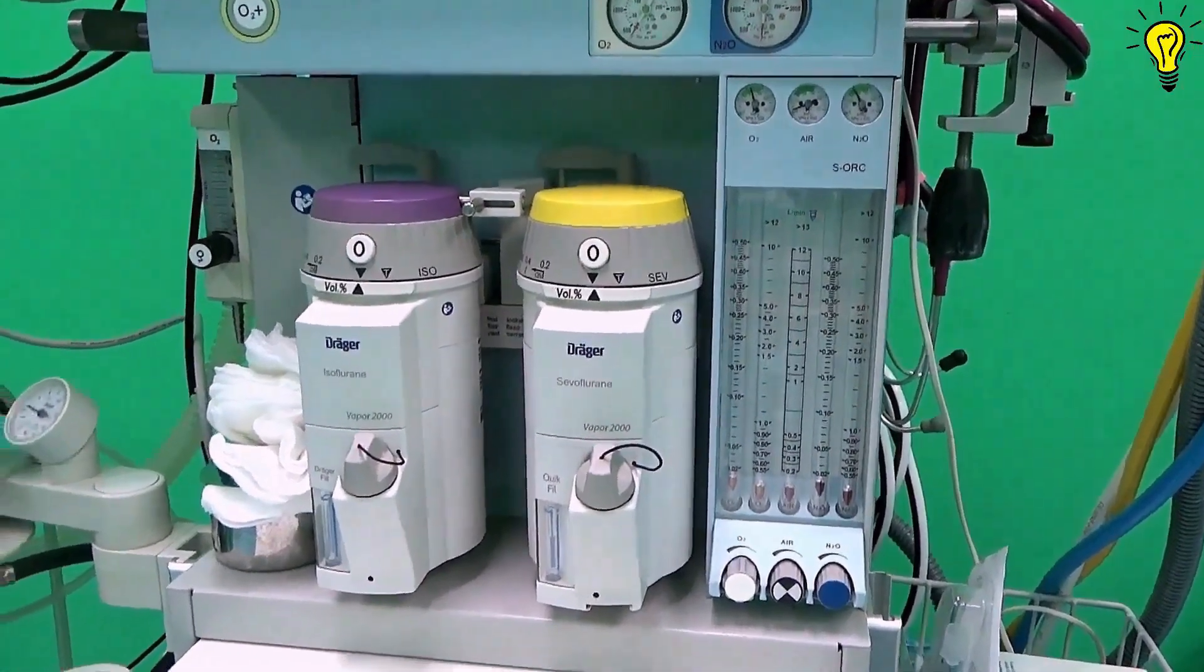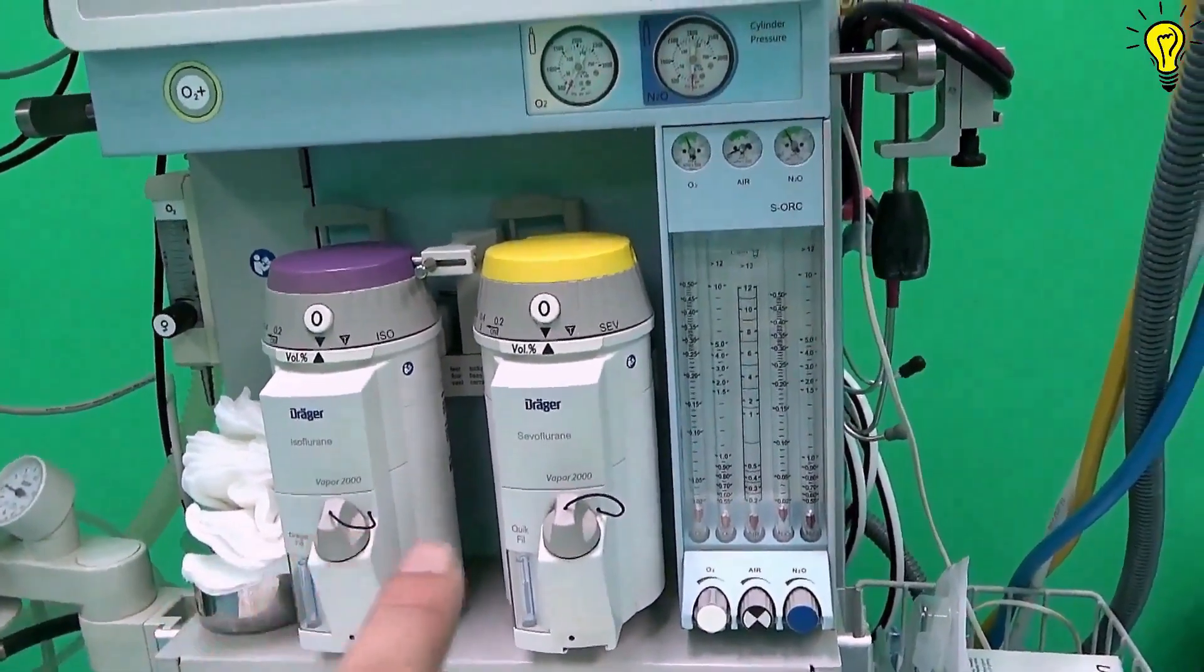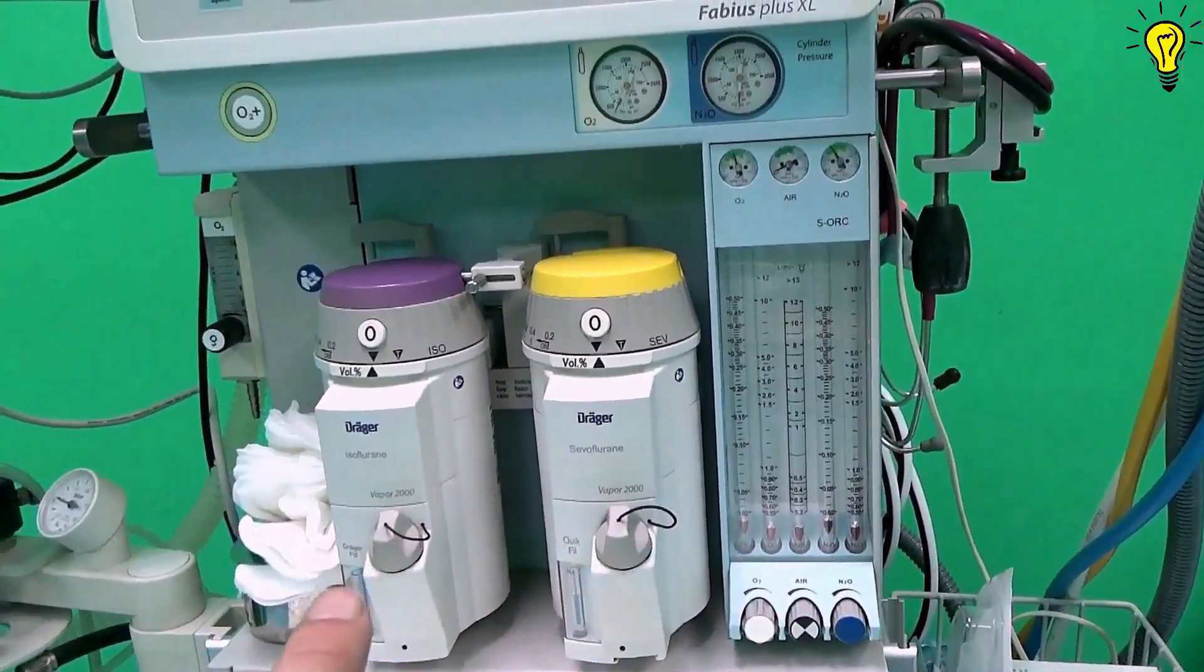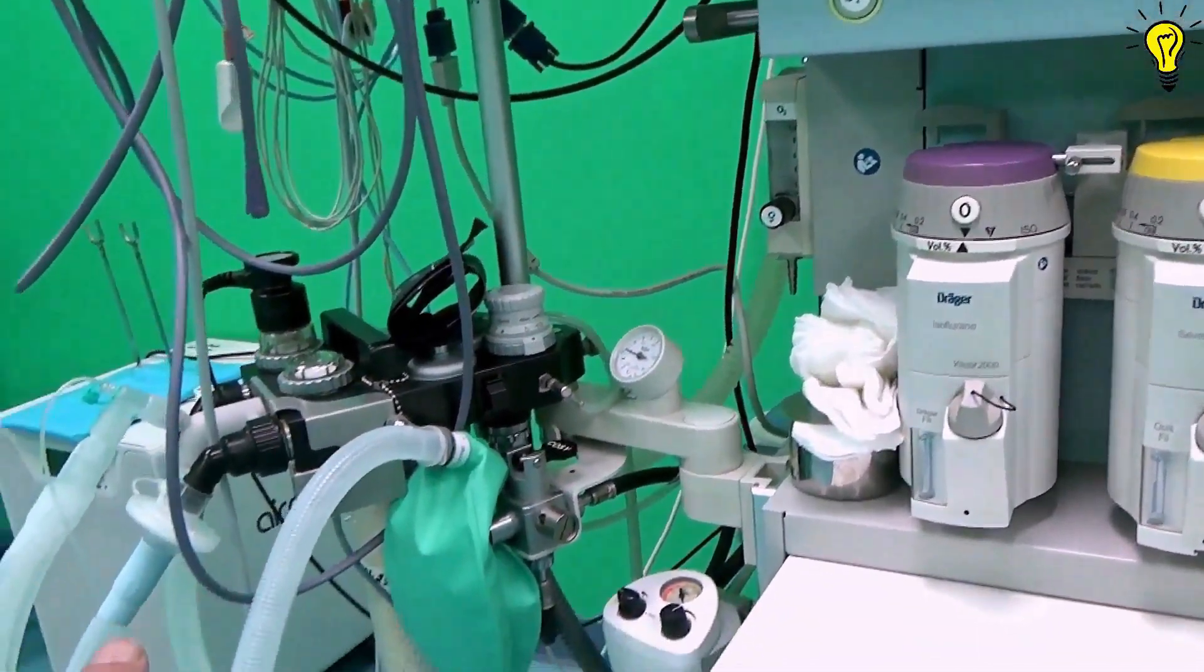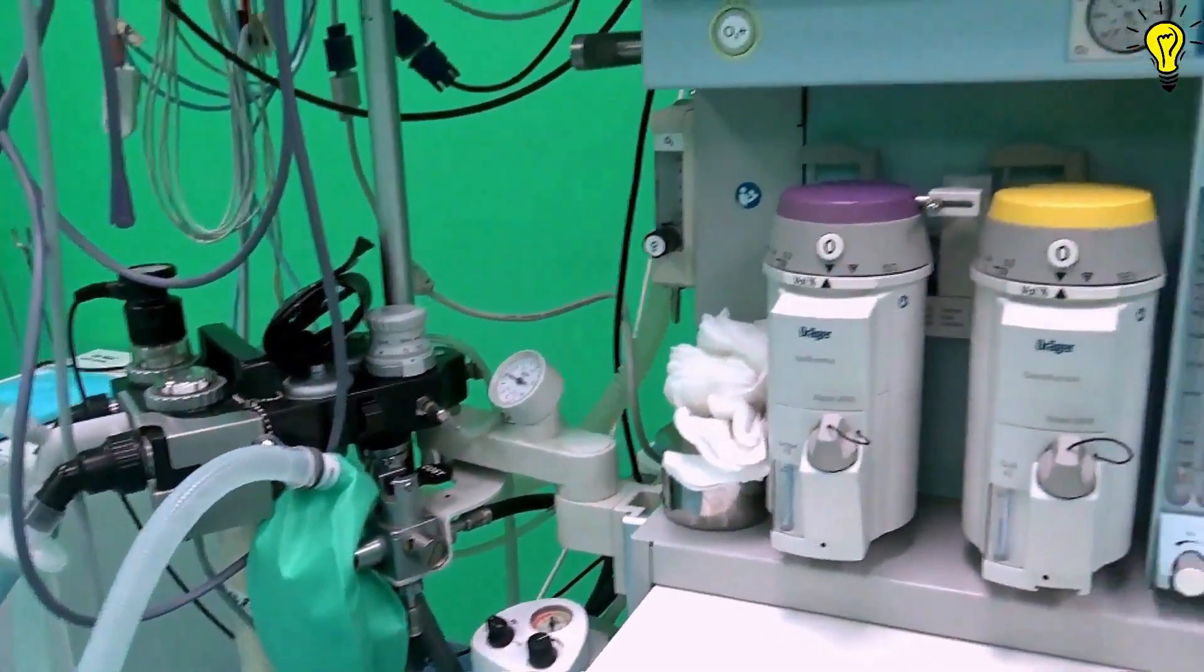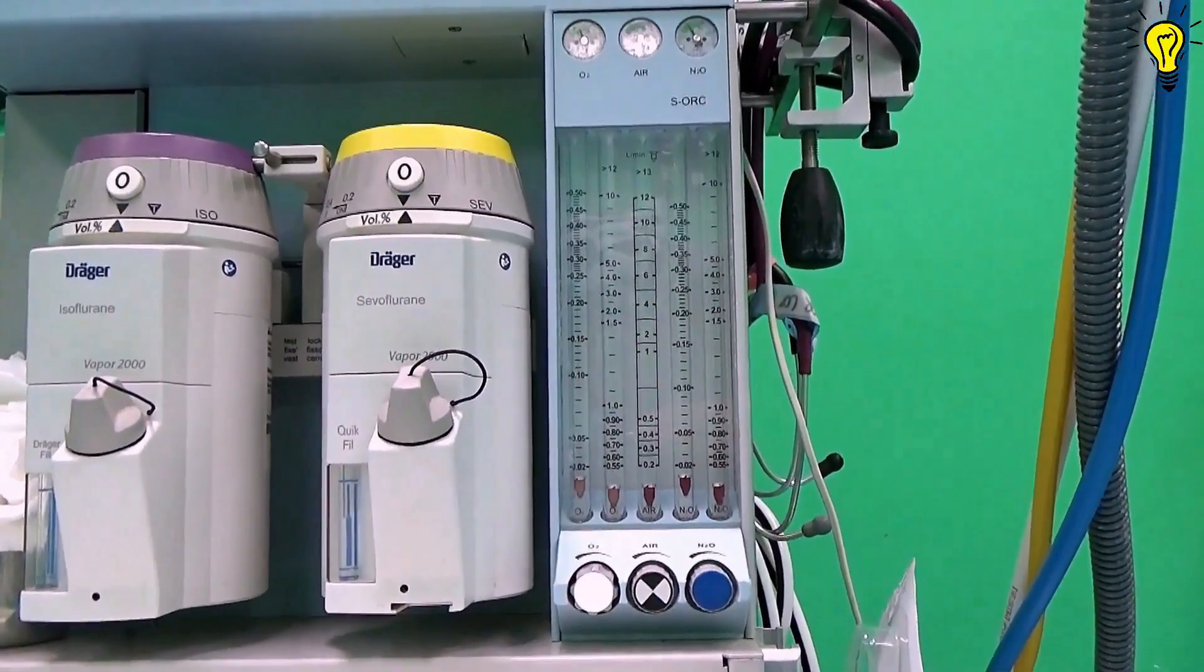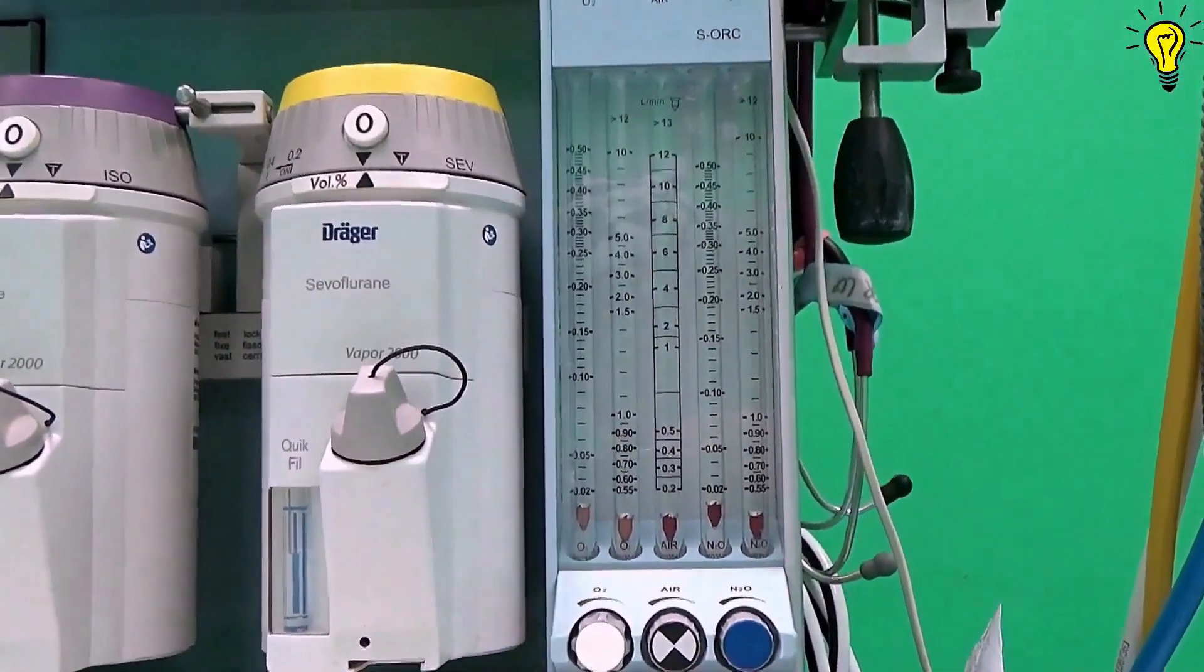Low pressure zone, the system most detailed and most susceptible to leaks, starting from the flow meters to vaporizers to the circuit. We will divide low pressure zone into a series of episodes to cover all. Let's begin with the flow meters then.